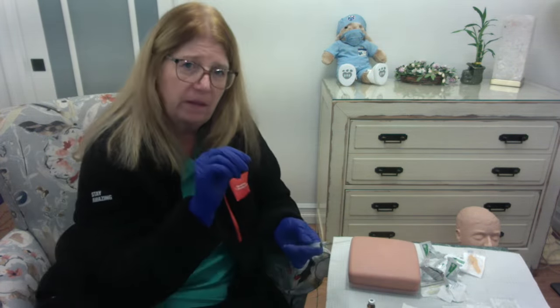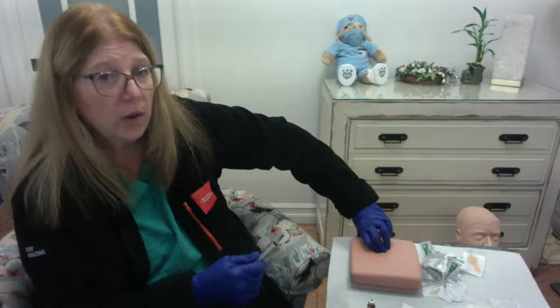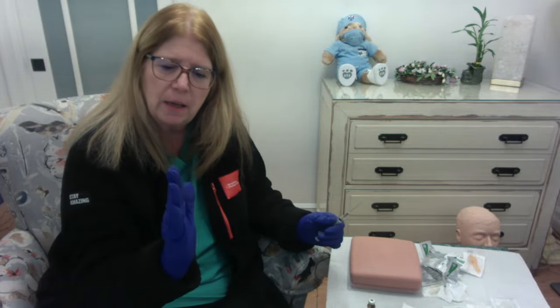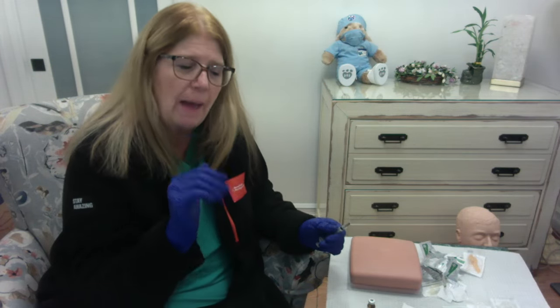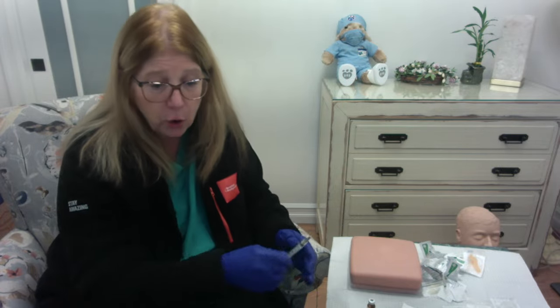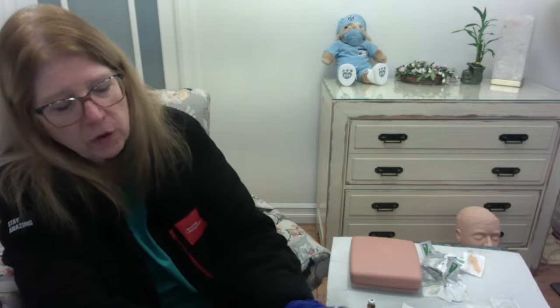So what I've done basically is I've displaced the subcutaneous tissue to one side. And instead of me having a straight track, I now have a track on the inside that goes like this to the side and up, kind of like a Z. And that prevents that medicine from moving from the IM area into the sub-Q area. How do you know which medications you have to give by Z-track? It will tell you in the drug insert or in your drug handbook, any one of those places, okay?